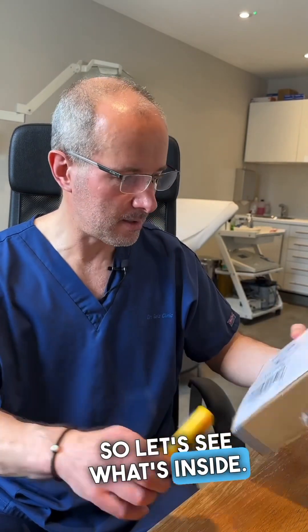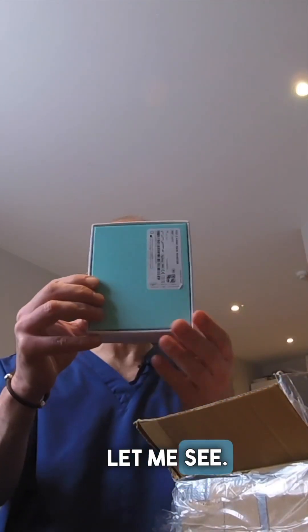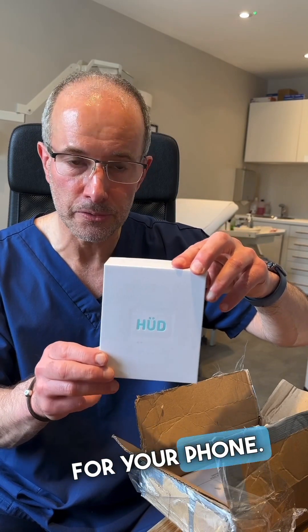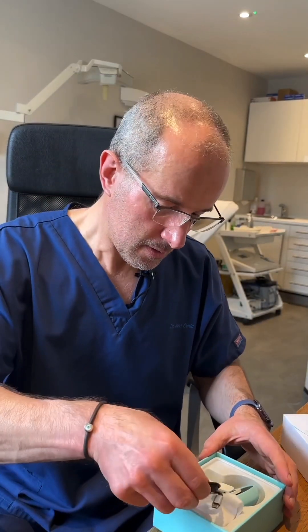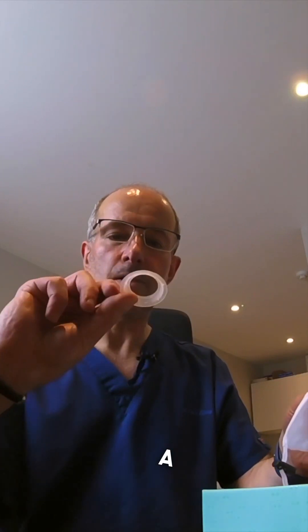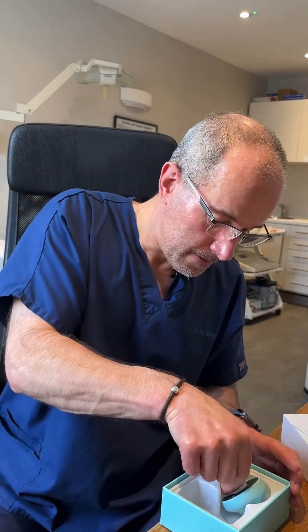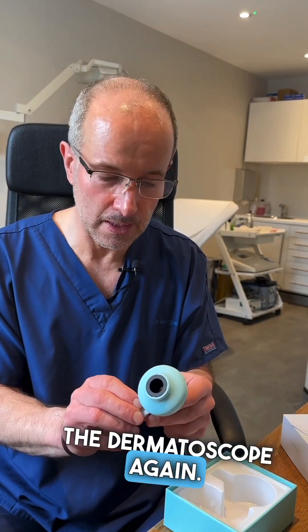So let's see what's inside. This is a DermLite HÜD home dermatoscopic adapter camera for your phone. Inside we have a charging cable, a contact plate, a tiny pocket, and this is how you attach it to the phone. And this is another contact plate, and this is the dermatoscope again.